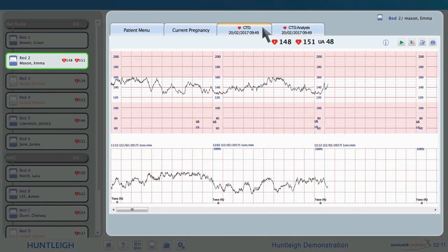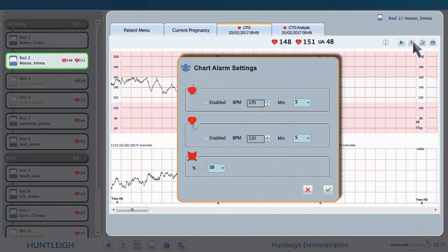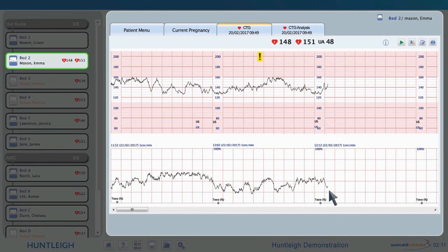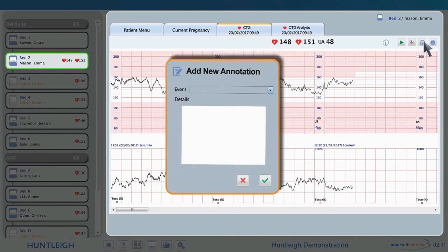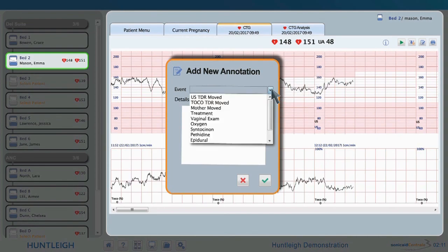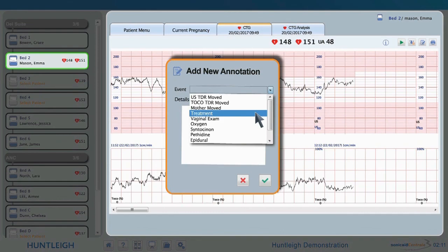By clicking on the CTG tab, we are back to the trace. By selecting the bell symbol, we can set the high, low, and loss of contact alerts. We can see when the alert levels were changed and to what value. This can also be seen in the patient notes if this information has been enabled for the user. To annotate the trace, click on the note icon and move the cursor to the required position. Use the drop-down list or type free text in the event box. Further information can be typed into the details box.